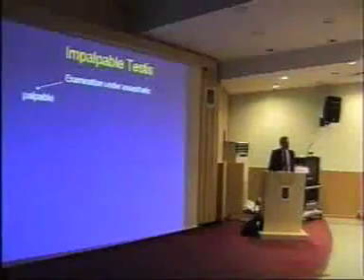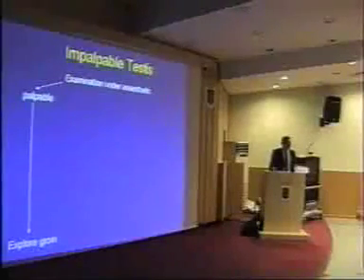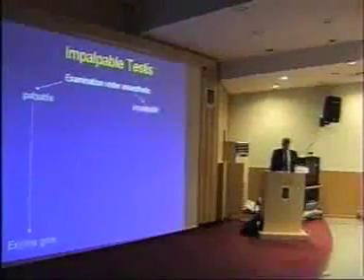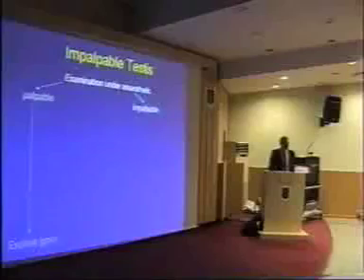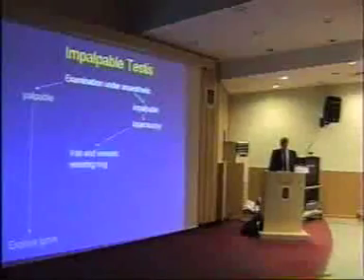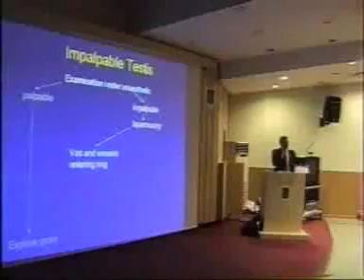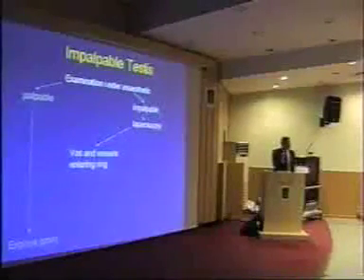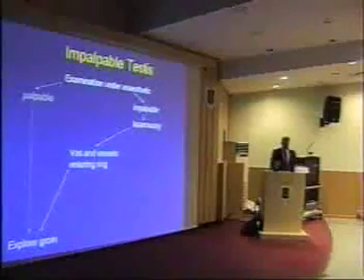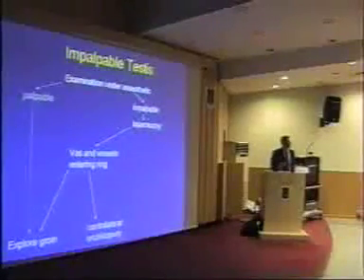If you can feel the testicle, then you just go ahead and do a groin exploration and a formal standard open orchidopexy. So that's 30% of the patients that you don't laparoscope. For the rest, you still can't feel it. You get the laparoscope out and do a diagnostic laparoscopy with a single port. If you see the vas and vessels entering the ring, it means one of two things. Either it's a chubby boy and you can't feel the testicle, but it's there after all, and then you can explore the groin and fix it in the scrotum in the same way, or it's not there, and if it's not there, you fix the other side.